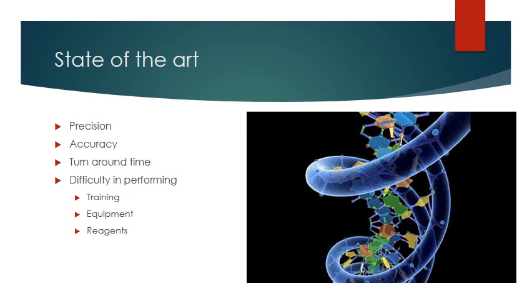So between those two, molecular techniques provide an attractive alternative to biochemical testing and cell cultures and fluorescent antibodies and things like that. In addition, the turnaround time of molecular techniques, while they're not as fast as certain instruments in, say, the chemistry or the hematology lab, when you're talking about the timelines that microbiology uses for culturing, molecular techniques are far and away better. You're talking about turnaround times of a few hours, in some cases a few minutes, depending on what the technique is, from setup.